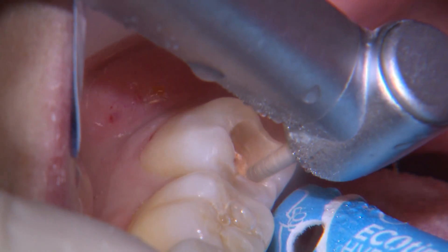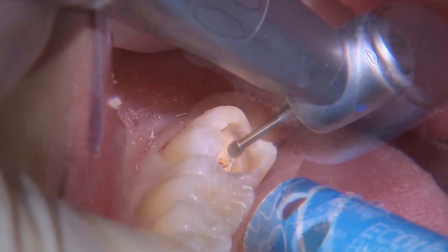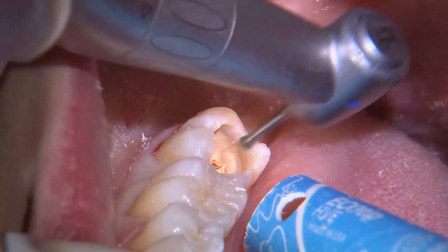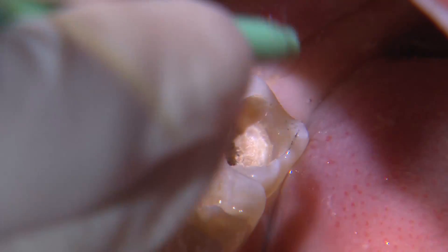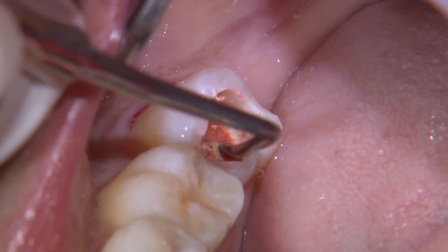Once a clean DEJ ring around the prep is achieved, I complete the rest of the caries removal with a slow speed round burr along the axial walls, while with light pressure, carefully advancing apically. I like to use caries indicator dye as an aid to help guide where demineralized tooth structure is, but keep in mind there may also be false positives.